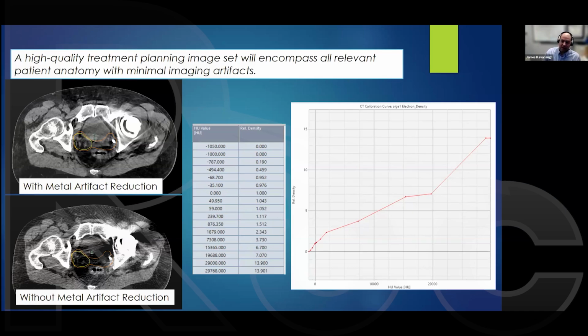But even beyond that, even if it has an extended range, is it accurate? And is it accurate depending on your dose calculation algorithm? So knowing what your HU to relative or even material density is, depending on the algorithm you're using, knowing how that will handle that high density material, and then having some preset rules would be very helpful on when you want to override it and how you want to approach overriding it, what material and or HU to assign it to make sure it's accurate.